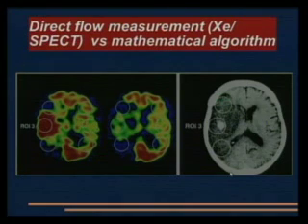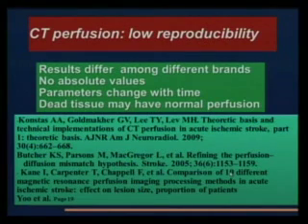And so they compared xenon with the injection of contrast and demonstrated that CT perfusion has a lot of disadvantages and errors. So CT perfusion has low reproducibility.